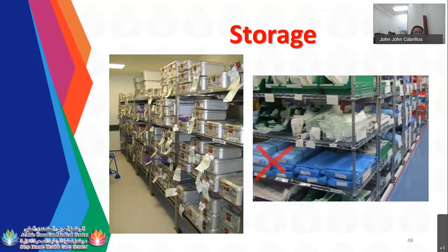you are allowed to overstock, but not too high. At least two, it's okay, but not that high. Or three. It can damage the lower part of the rigid container. You need to check your IFU also if you are allowed to overstock, because sometimes it is not allowed to overstock. So do not overstock packages for rigid container. You can overstock them, but not too high, as the weight may damage the lower container. You need to check the IFU.